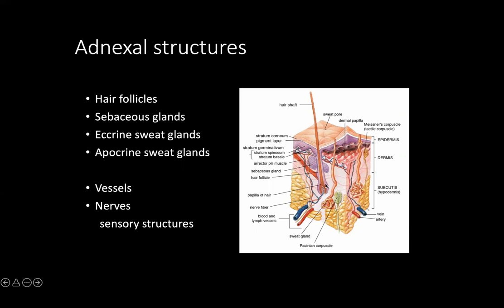So understanding normal hair follicles is going to be critical for understanding neoplasms, but not only neoplasms, but alopecias as well. We're not going to be able to get into it for this lecture, but there's a whole host of different types of alopecias, and understanding the normal hair follicle structure and the normal hair follicle cycle will get you one step closer to understanding alopecias, which are essentially hair loss due to various types of pathologies.